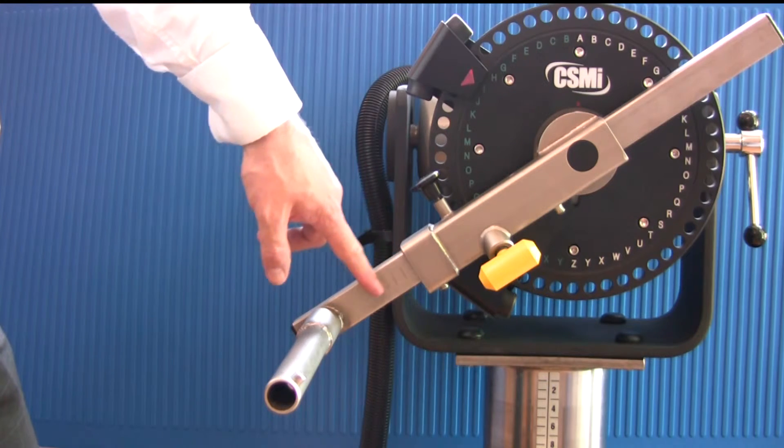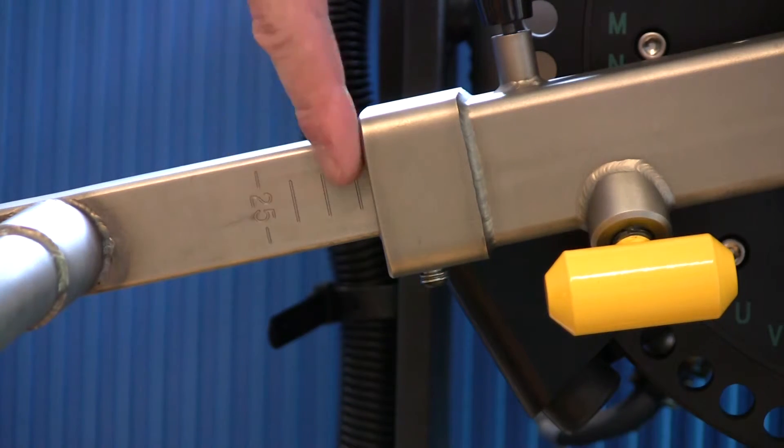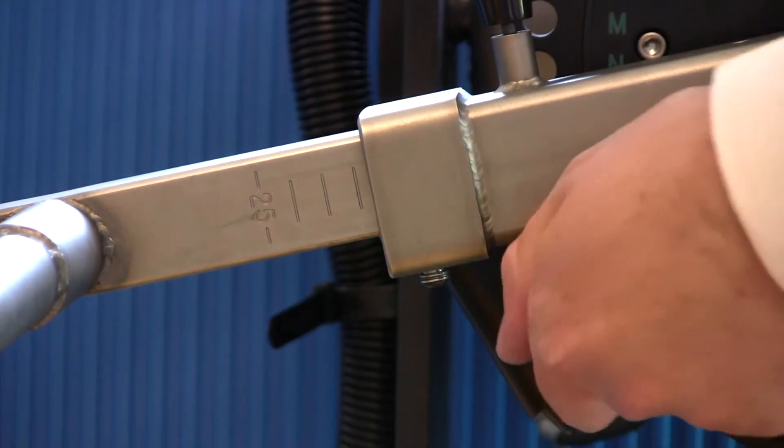Top tip: when applying the adapter for knee tests or exercises, start by setting it too high as it is easier to lower onto the ankle.